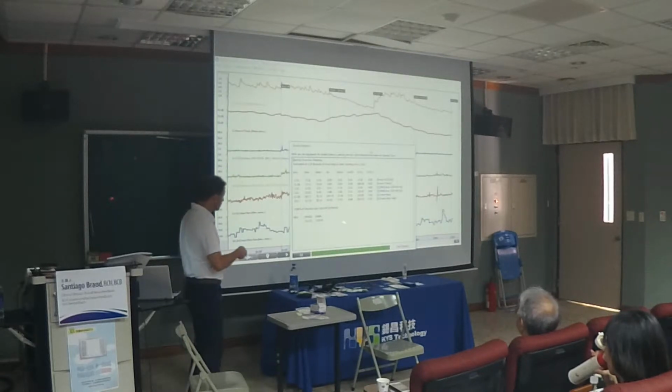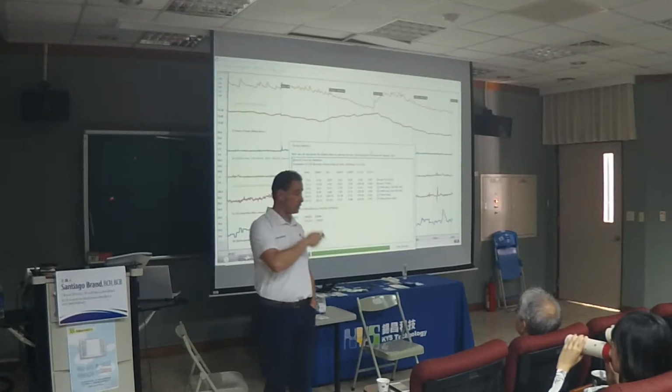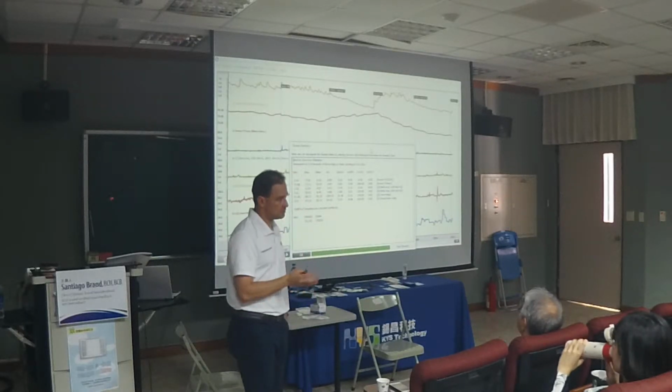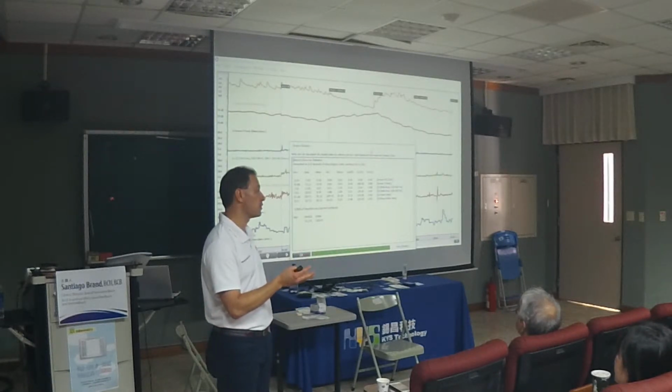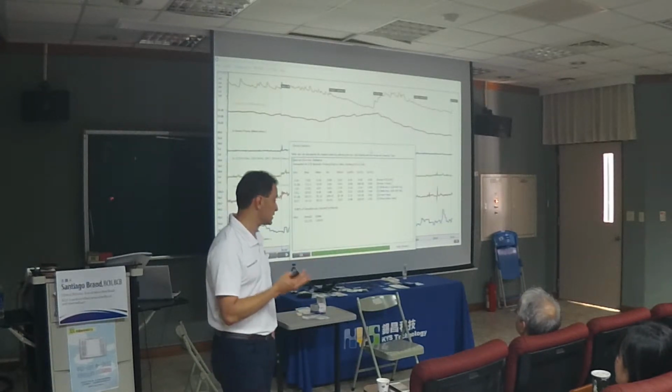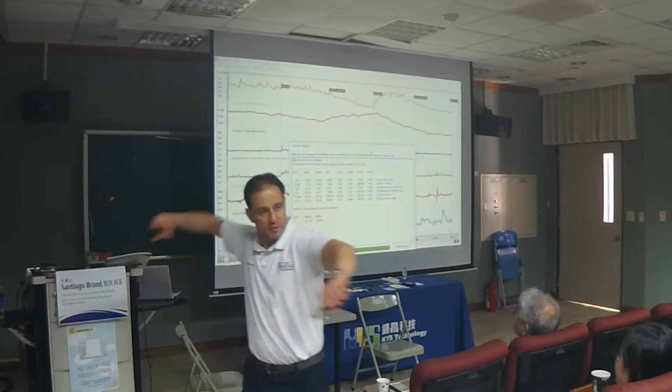So what went up? The respiration and the EMG, right? Temperature went down. So here's where we start paying attention to things. Oh, muscles went up, so it might be something we want to train when he's stressed out. Because at the catcher, you have to throw it back to the pitcher. Or if somebody's stealing second base, you have to throw it to second base, right? So think about it. The movement is something like this.